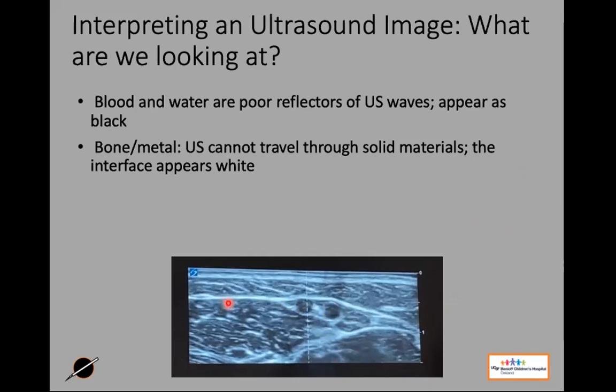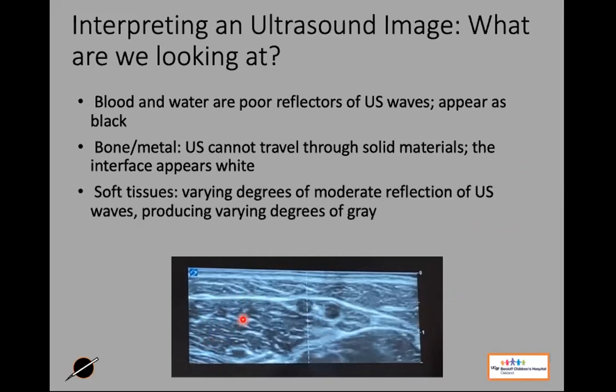And then we see these other highly reflective white areas. That's the fascia that runs through and creates our compartments around veins and nerves, muscle tissue, creating layers in the skin. So down here, we've got some muscle tissue. So soft tissue, this stuff down here, varies in reflectance. And so we're going to get all kinds of information when we're trying to insert our needle into the tissue. So we need to be thinking about that.